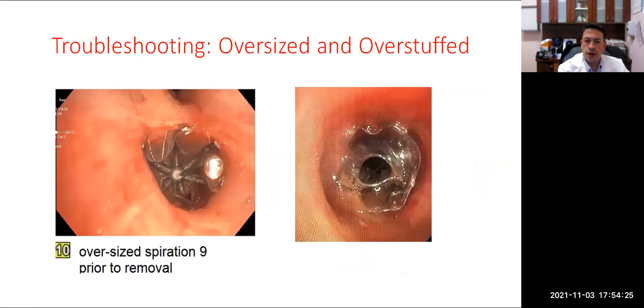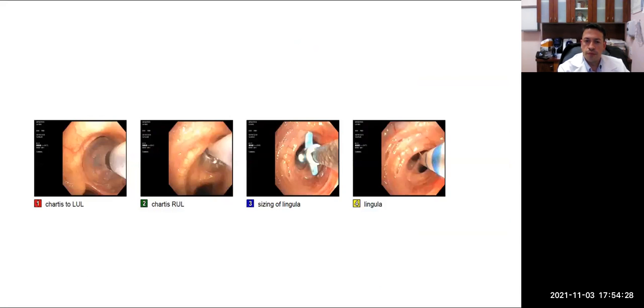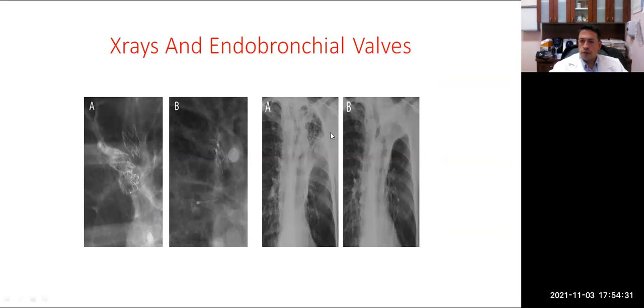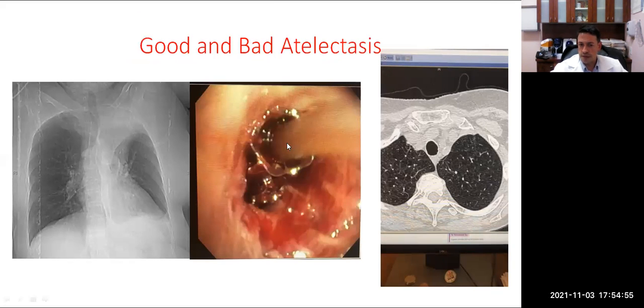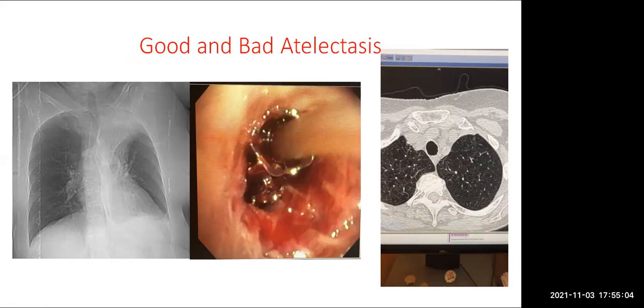I'm just trying to see if I have an X-ray of the patient I showed here. For example, if you look here, this is a great one, because here you really have a thin sliver. You could see that there is tracheal deviation. There is obviously hyperexpansion of the lower lobe, but there is very little left of the upper lobe. It almost looks like a thin pancake, and those are the best ones. That's why on that other case, when I went back in and bronched her, there was all that pus that came out. So you could see that there's a difference even on a chest X-ray. You could appreciate the different appearance of the lobar collapse. Okay, thank you.